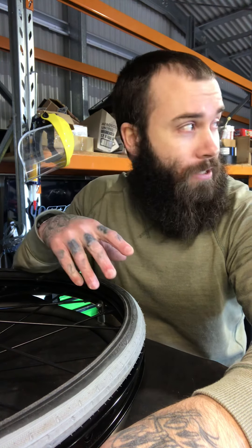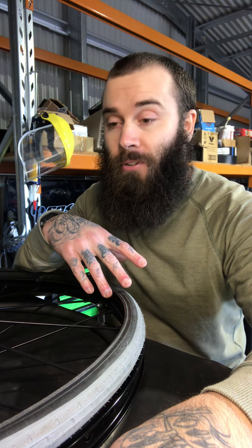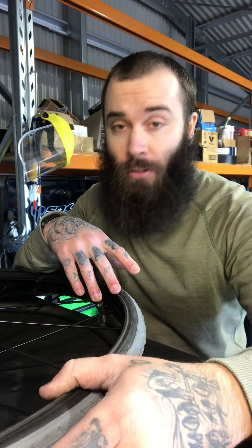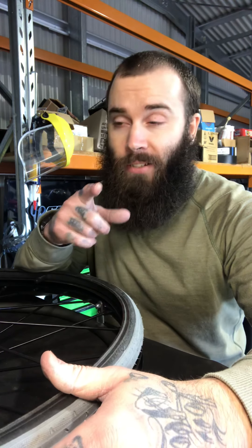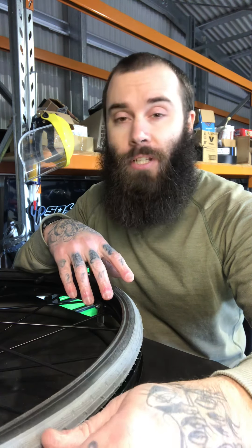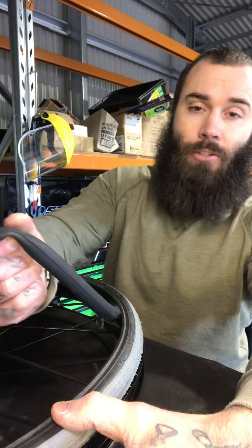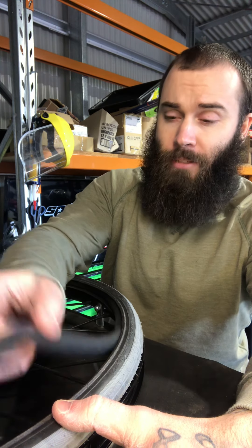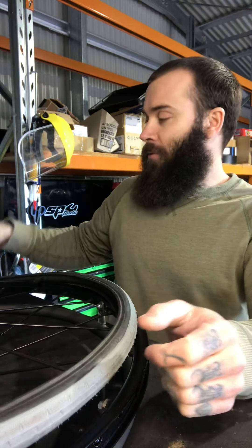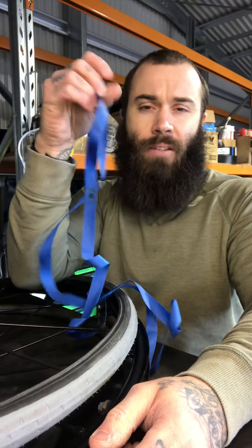What's up guys, another public service announcement. Today I'm going to walk you through how to change a tube on a wheelchair tire — not a car. What you'll need: a tire, a tube, and some rim protective liner.